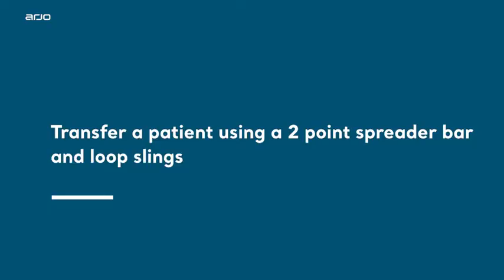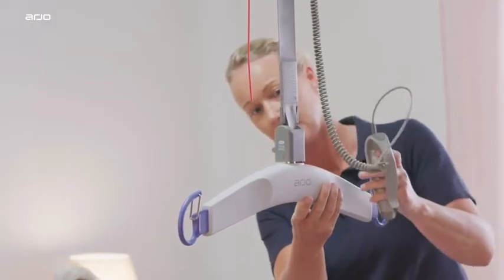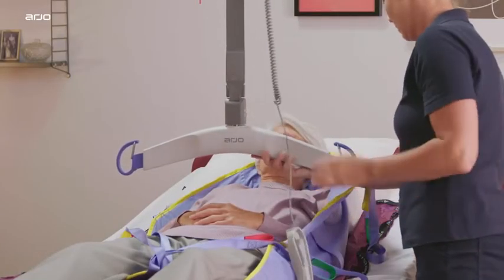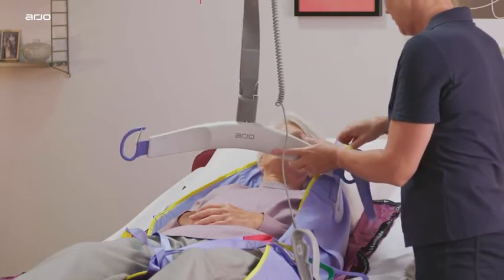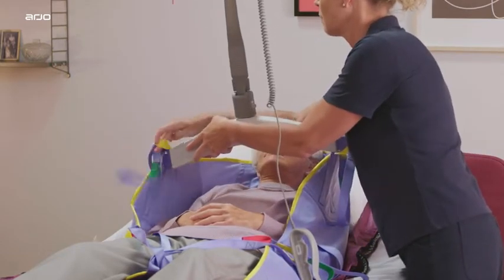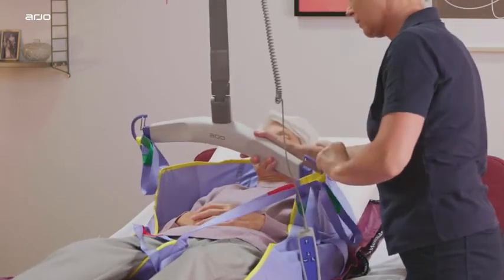Transfer a patient using a 2-point spreader bar and loop slings. Ensure that the spreader bar is rotated into position before attaching the sling. When attaching a loop sling to the loop spreader bar, always ensure that the sling attachment loops are installed correctly into the retaining hooks. Use Arjo loop slings with a loop spreader bar.